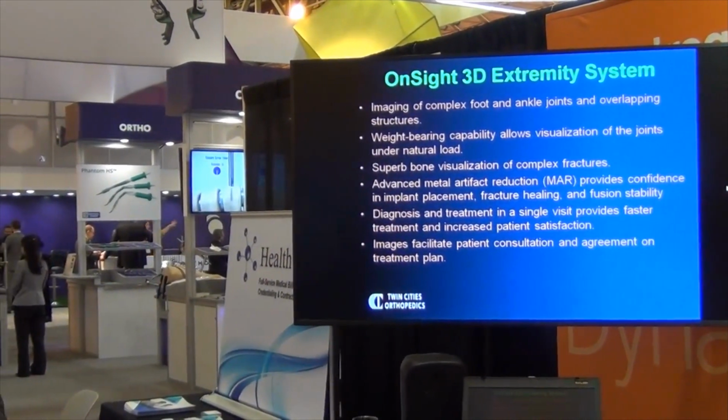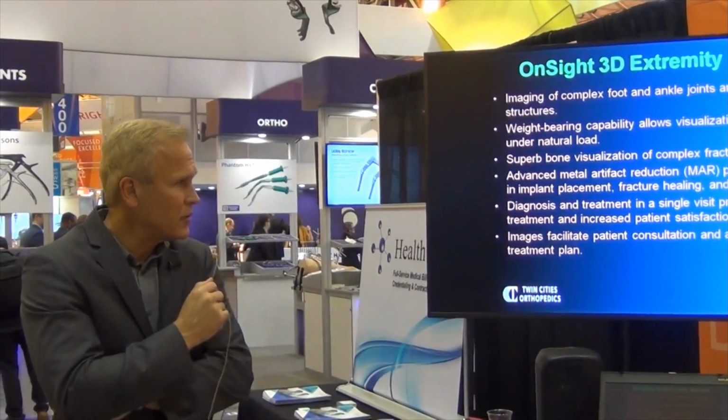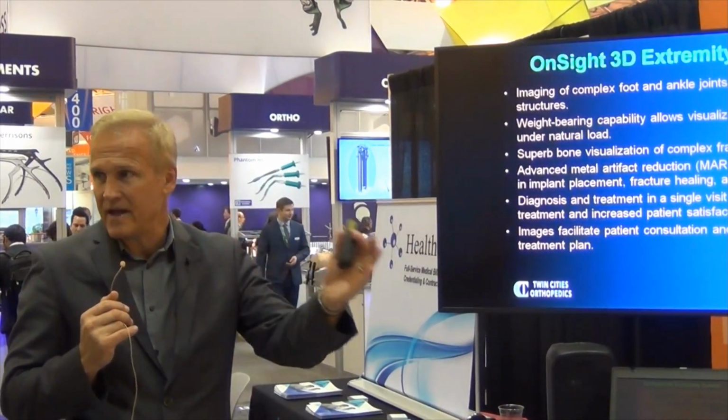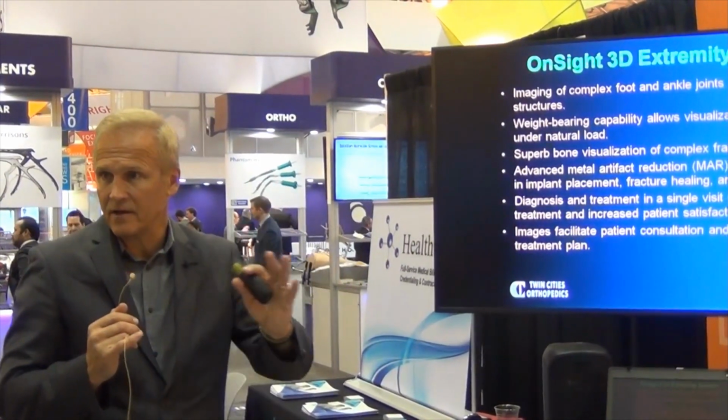So for me, the images facilitate patient consultation and agreement on a treatment plan. Again, it's when you work that into your patient clinic workflow. Now I know, my staff knows that certain new patients that have just plain x-rays, but they have a lot of deformity, that I want a standing CT scan, so they bring the patient in a half an hour early before they're supposed to see me. So they work that into the flow, and the x-ray techs are ready to do the scan. And so by the time I see them in a half an hour, the whole CT scan is rendered, and I can just look at the images on the screen in the exam room with the patient.